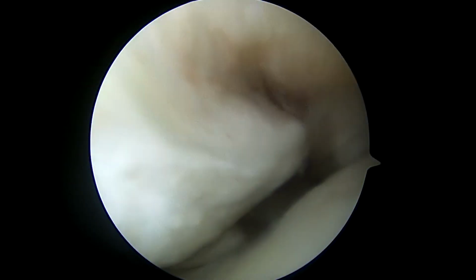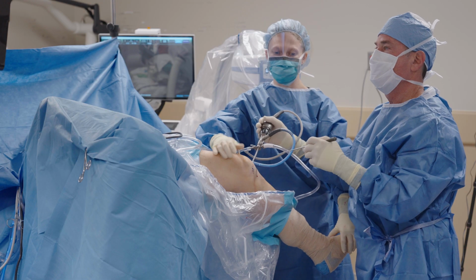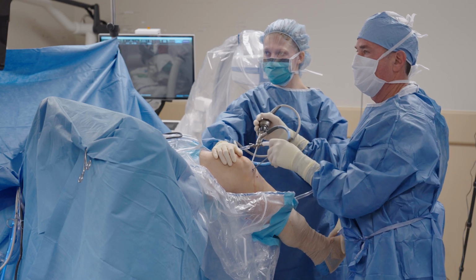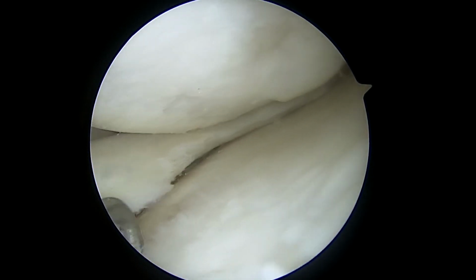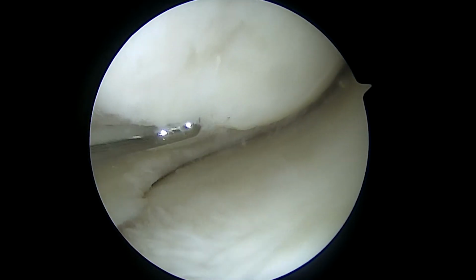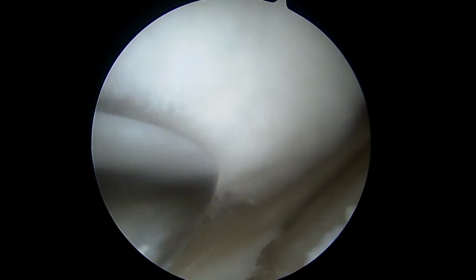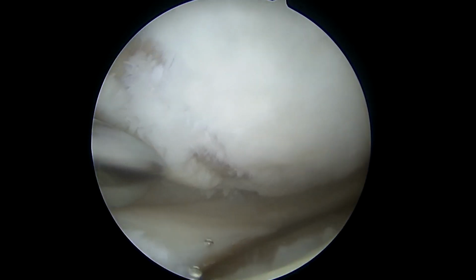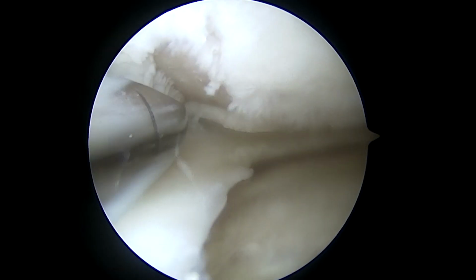Typically what we find is that the pathology intra-articularly correlates where the subchondral insufficiency fracture, represented by the edema, is seen by MRI. So his medial tibial plateau wear is really just where the MRI shows the insufficiency. Here is his medial femoral condyle, large area of involvement. So you can see there's sort of a kissing lesion environment with bipolar disease, which is about what I expected given his pre-op radiographs and pre-op MRI.